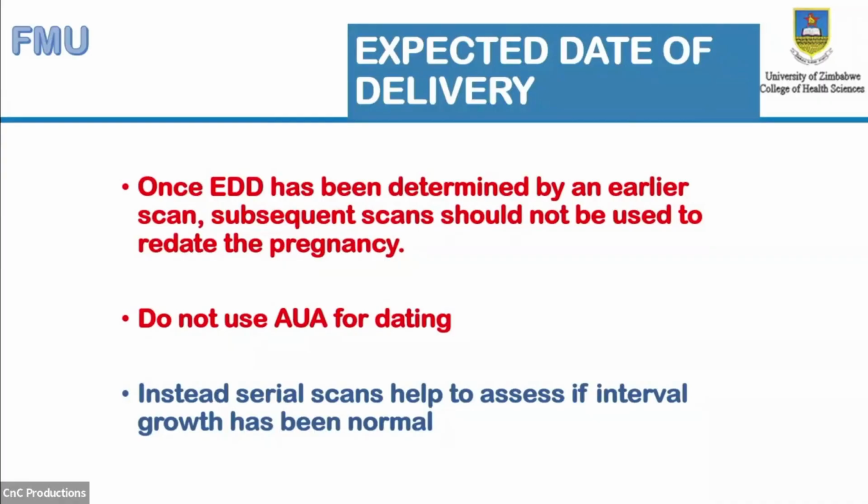And sometimes it would be going forward, sometimes it would be reversing, sometimes it would actually make the woman happy to say, yeah, I think that one aligns with the birthday of the great uncle or something like that. So the ideal thing is once an EDD has been assigned, we stick to that so that we can pick if there is growth restriction or overgrowing of the baby.